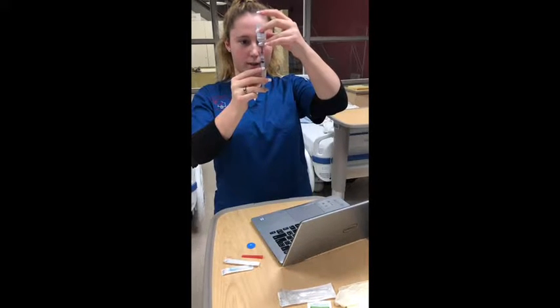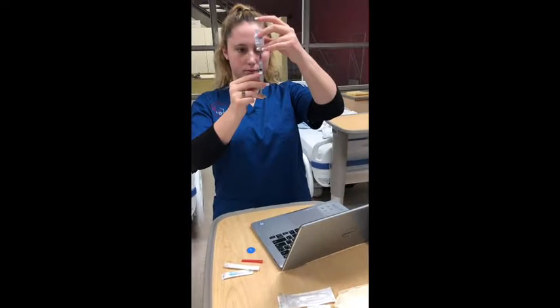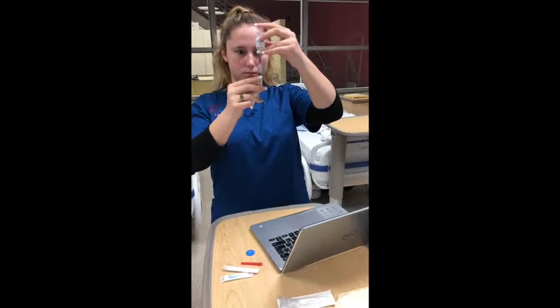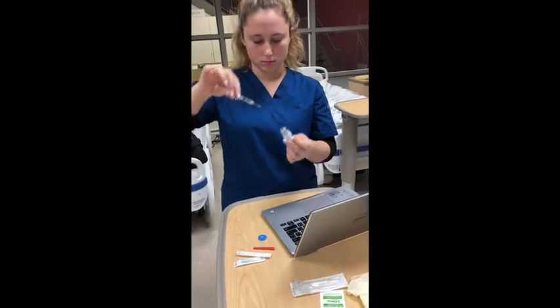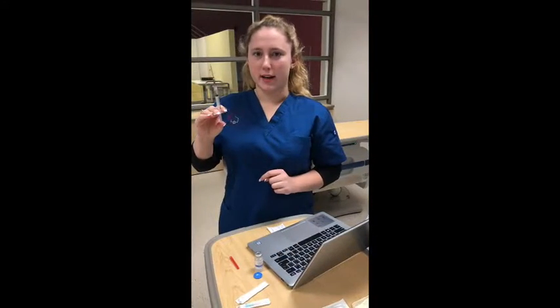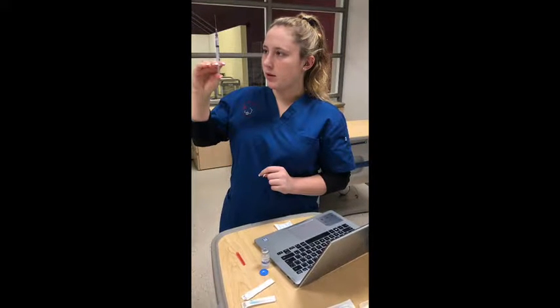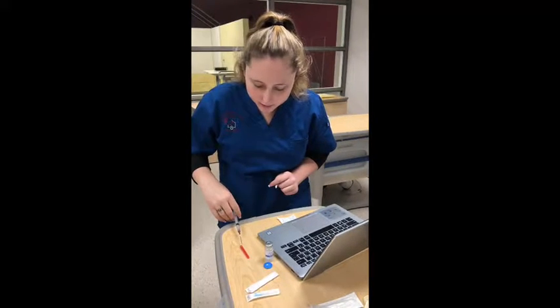And pull back 1 milliliter of the medication. So I'm going to get out any air bubbles that I have in my syringe by pushing up a little bit. And once I've done that, I'm going to recap it for safety.